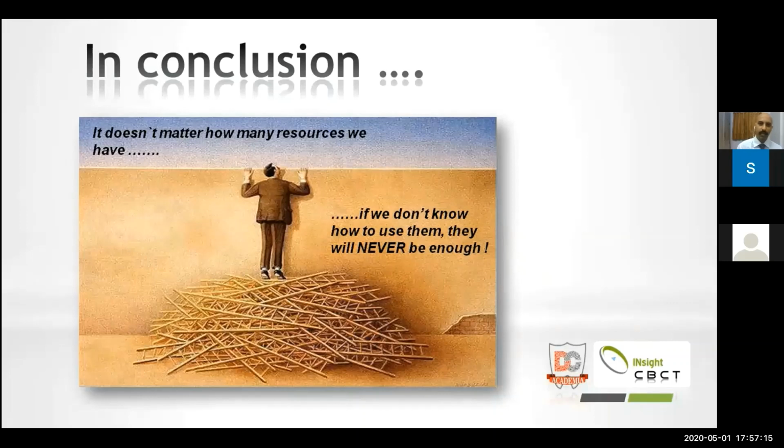And the best person to tell you about all of this, I would like to invite our senior colleague, Dr. Dinesh Jain, who has been an implantologist for the past nearly 4 decades. And he has been using guided surgeries as well in his practice for nearly a decade now. He has a wealth of information about the advantages that he has faced using guides, as well as the limitations. I would like to invite Dr. Jain to give us a brief clinical overview of his experience having used 3D printed surgical guides.